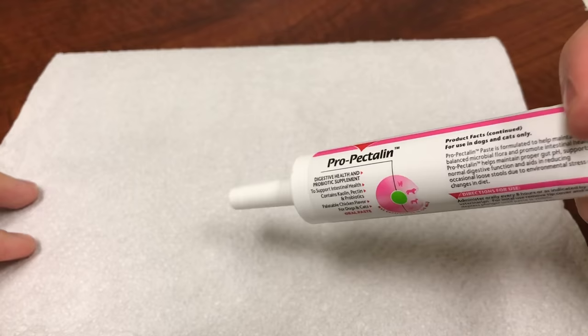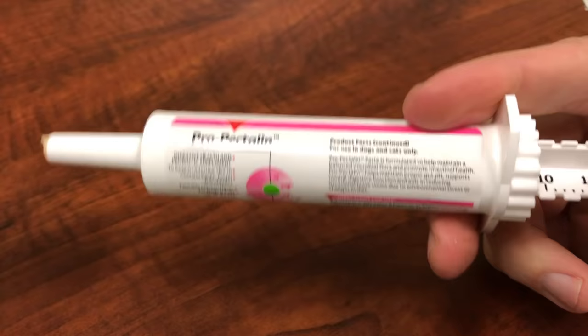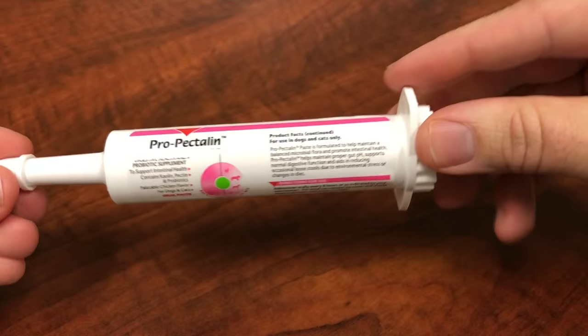Next, depress the plunger all the way down to the end of the syringe. After you have administered, replace the cap on the end of the syringe and store at room temperature.